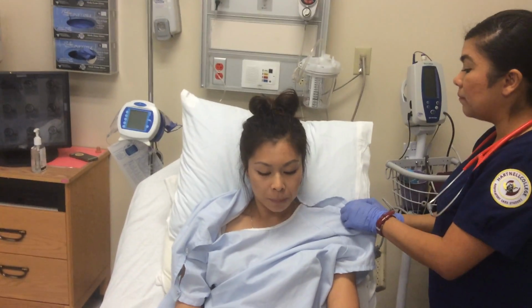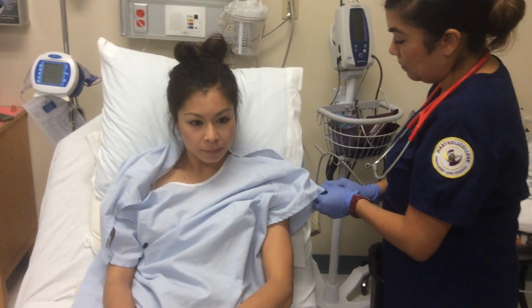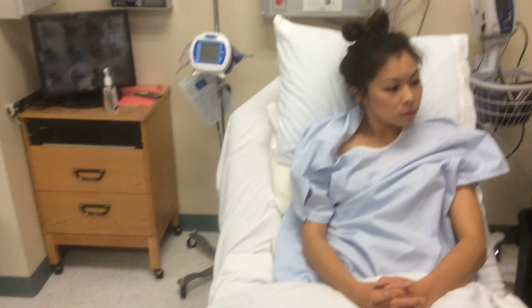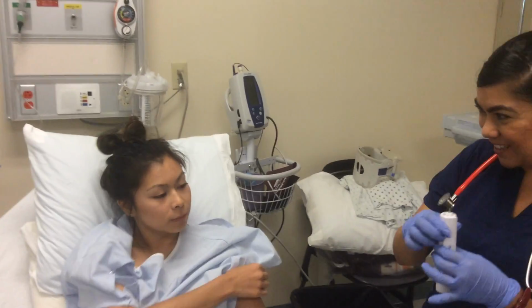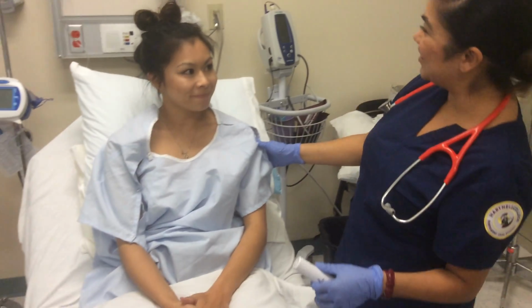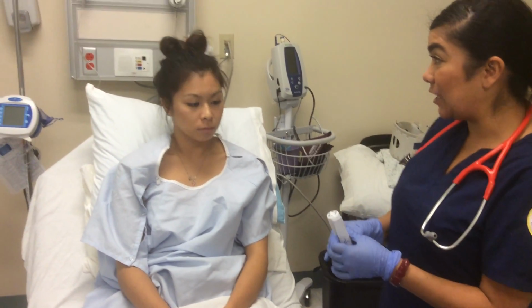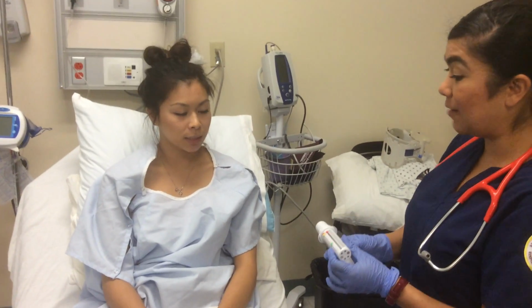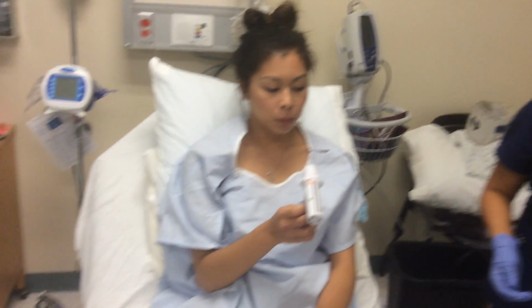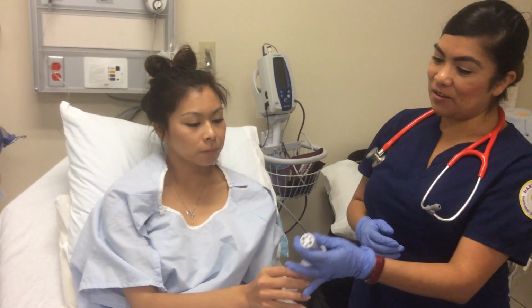How are you feeling? Good. Okay. Are the jitters already starting to go away? Yes. Okay. Very good. Thank you. Okay. And then now I'm going to go ahead and perform this peak flow once again. Remember, we want to make sure that we see a 20% increase. Very good. Remember to sit up. Thank you. And so remember, we want to reach our goal of 418. Do you remember how to do it? Yes. I'm just still going to walk you through it. Okay. So if you could just breathe out, and boom. Very good.